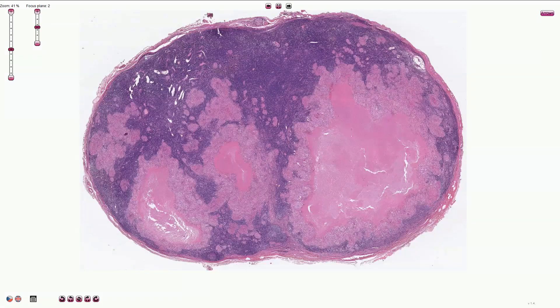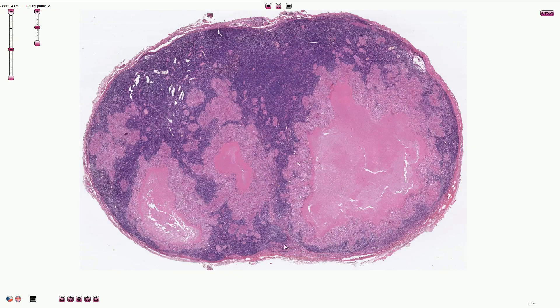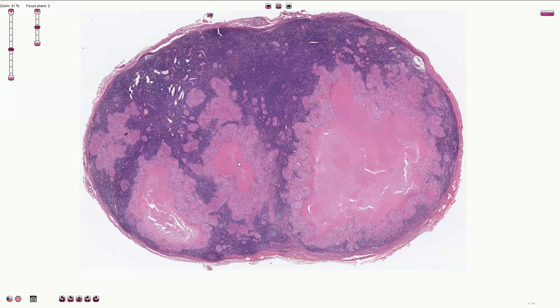Here we see Mycobacterium tuberculosis lymphadenitis, or tuberculosis of the lymph node, which is characterized by multiple granulomas with caseous necrosis. Here we can see the capsule of the lymph node, and in the periphery we can identify the residual follicles with germinal centers. However, the rest of this lymph node is infiltrated by these granulomas with caseous necrosis inside.